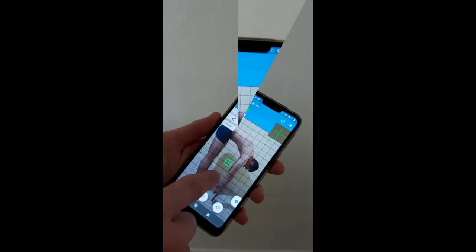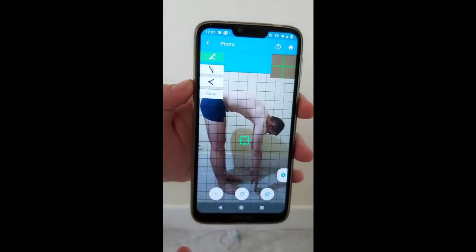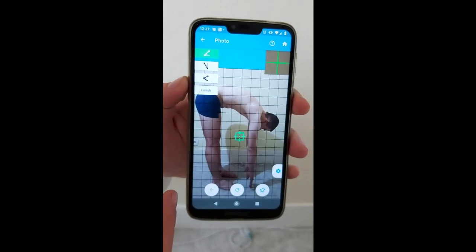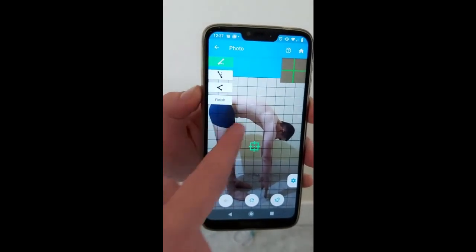Master mode allows you to measure custom angles and create personalized evaluations. Come here, I will show you how it works. The analysis interface remains the same. To pin or remove markers, use the controls at the bottom. To select the type of angle that will be measured, you use controls over here.